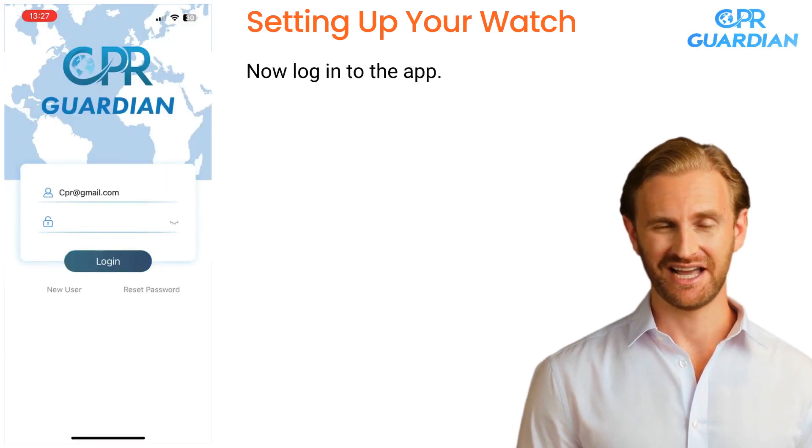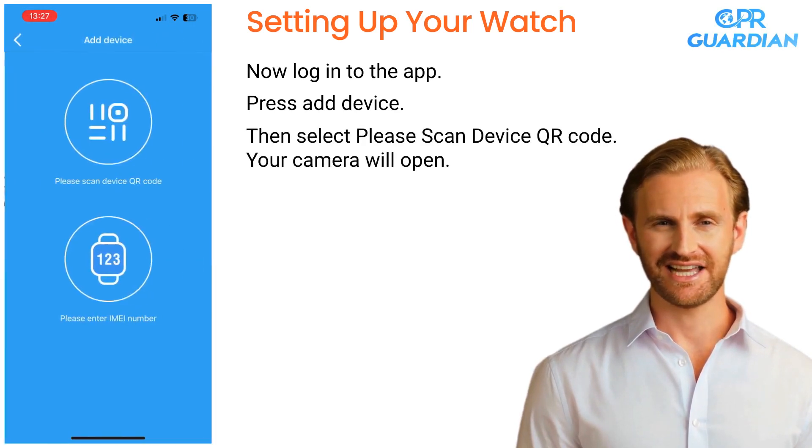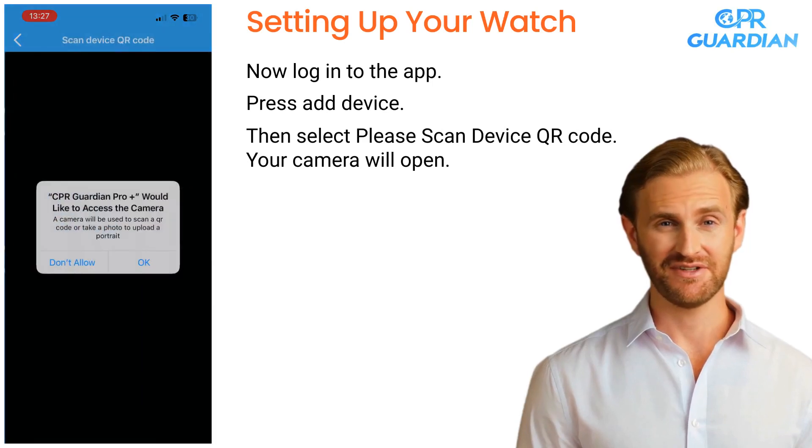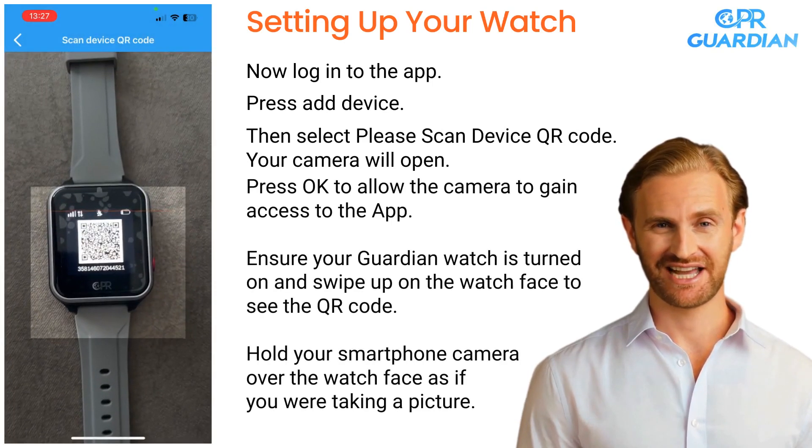Now log in to the app. Press Add Device, then select Please Scan Device QR Code. Your camera will open. Press OK to allow the camera to gain access to the app. Ensure your Guardian watch is turned on and swipe up on the watch face to see the QR code. Hold your smartphone camera over the watch face as if you were taking a picture.